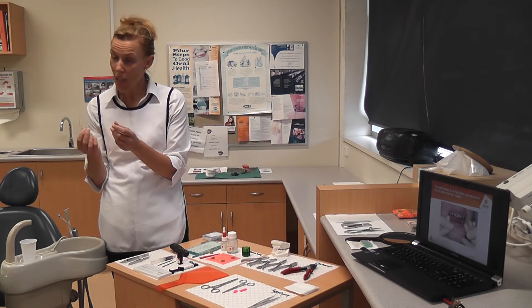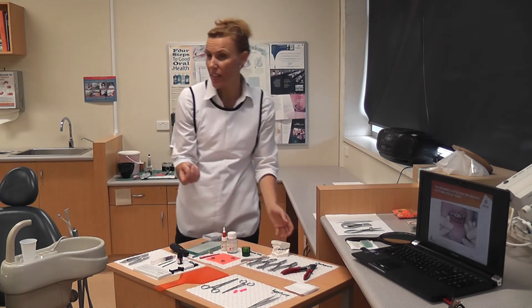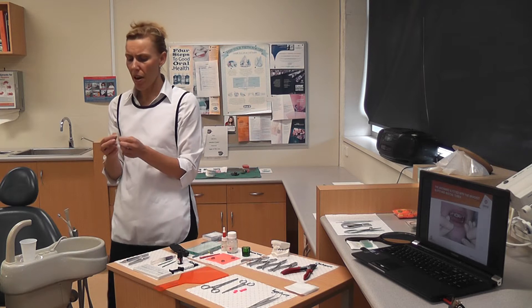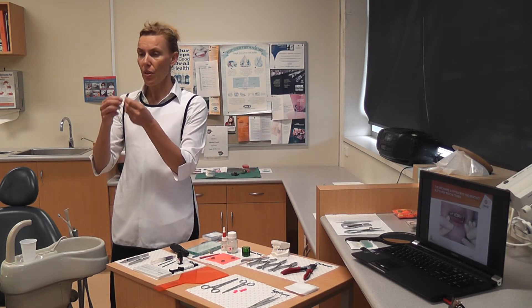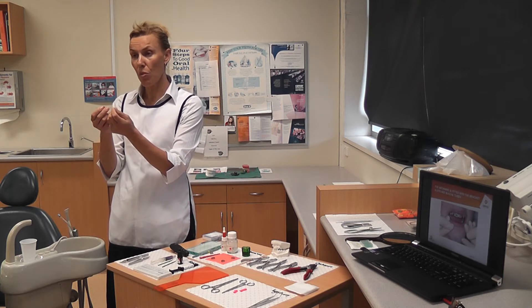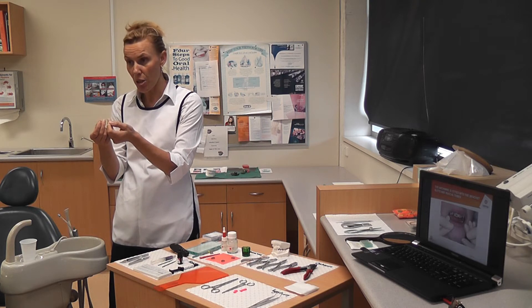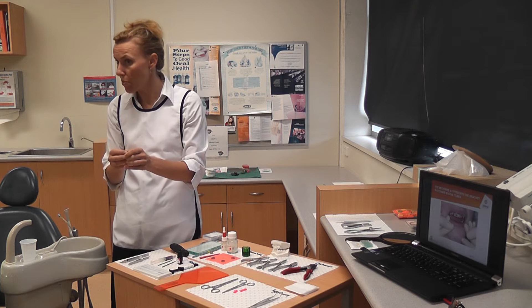The operator can use the study model as a guide to trim it back a little bit before we start. The new arch wire is apparently a new type of metal that actually has a memory. It is designed to be this shape, so when it gets bent, it automatically wants to pull itself back into the arch position, which is how it pulls the teeth back in. They've got these new metals with a memory in them.